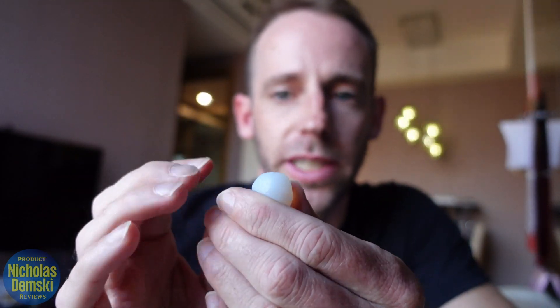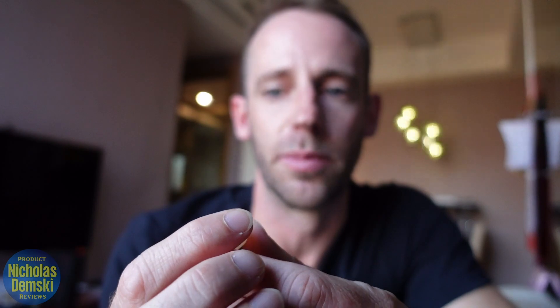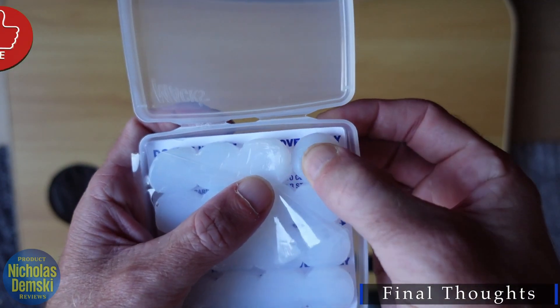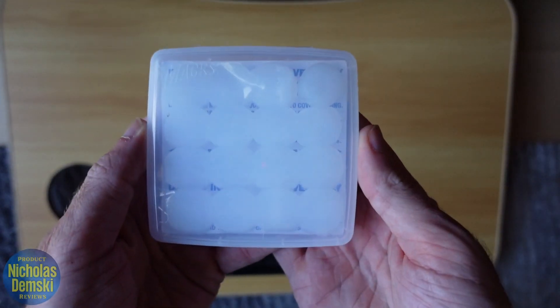These don't last forever — as you use them they'll start to pick up little bits of dust and hair from rolling around on your pillow. You can judge when it's time to get a new one once they've got hairs on them that aren't coming off. I probably use them for about a week, maybe two weeks tops, then put in a new pair. Until then, I just put them back in the case, squish it down, cover it with the plastic, and there you go.